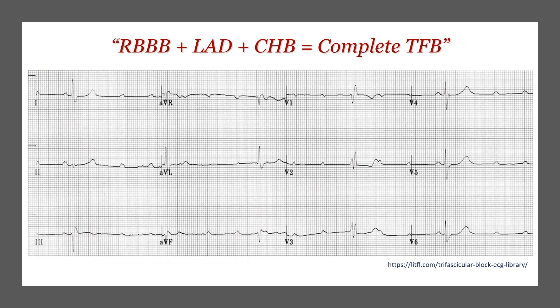Lastly, looking at this ECG: we have right bundle branch block, and the axis shows lead one pointing up and AVF pointing down — left axis deviation. Checking the P waves, they are not talking to the complexes at all, so we have a complete heart block. Combining the three findings gives us a complete trifascicular block.